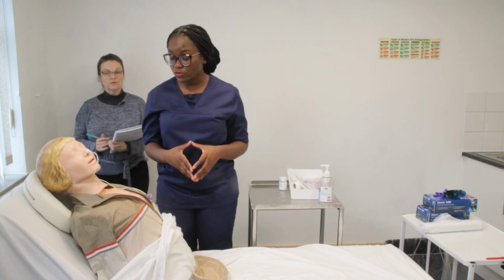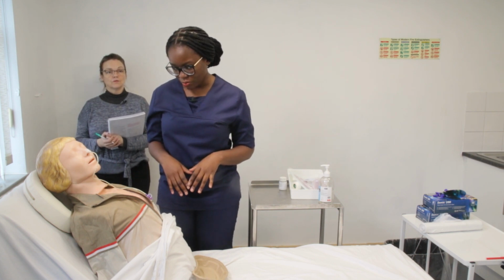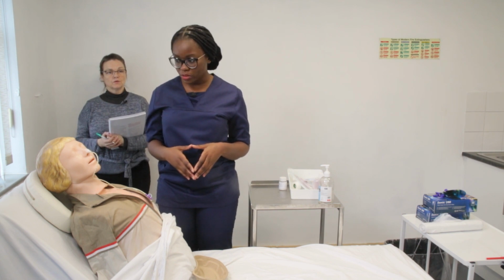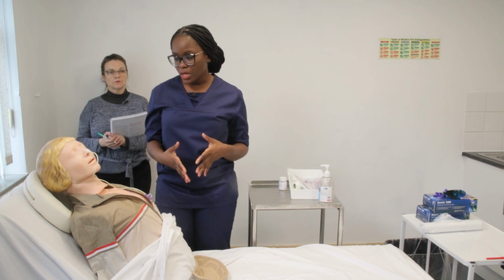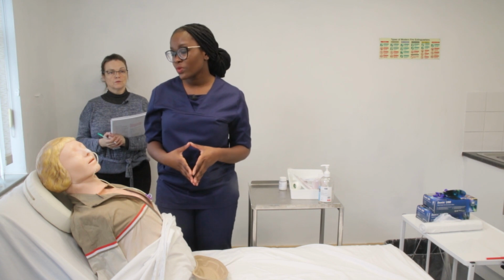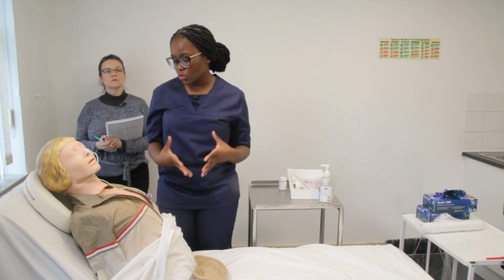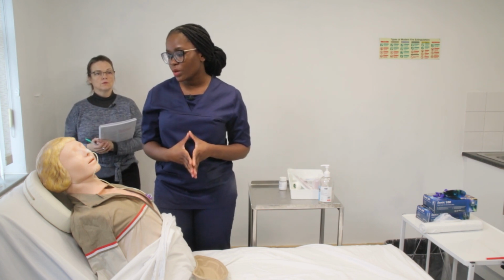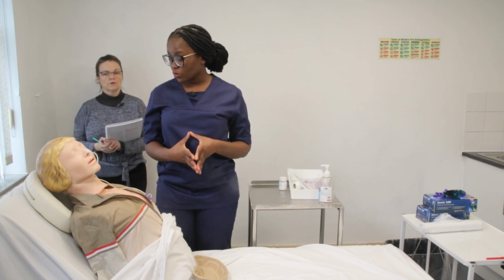You have a pH of 2, which is below 5.5. So the tube is actually in the right place, okay? But before we use this tube to feed or give medication, we will have to check your pH again. If you vomit, or there is any coughing or any retching, or if we notice any respiratory symptoms, we would do another pH test. Or if there is any displacement of the tube at the nostril, we will check your pH again. Do you have any questions for me at all?